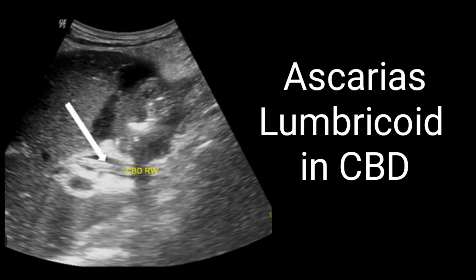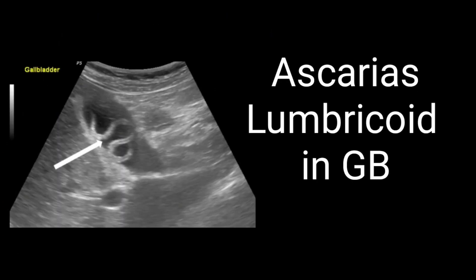Another infection is Ascariasis. A single Ascaris lumbricoides worm is identified as a tubular structure with parallel echogenic lines within the bile duct. On this image you can appreciate the echogenic parallel lines within the CBD — this is Ascaris lumbricoides within the CBD. Sometimes Ascariasis can be seen within the gallbladder as well. Mention on the report that an echogenic tubular structure is seen either in the gallbladder or within the CBD, and that the findings are suggestive of Ascaris lumbricoides — clinical and laboratory correlation is also suggested.